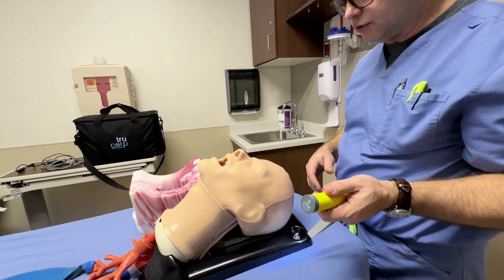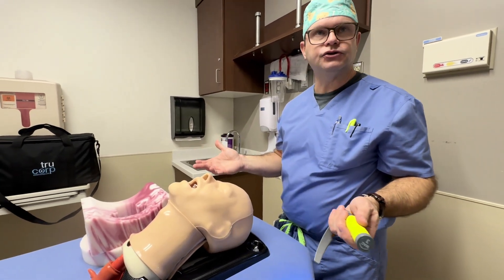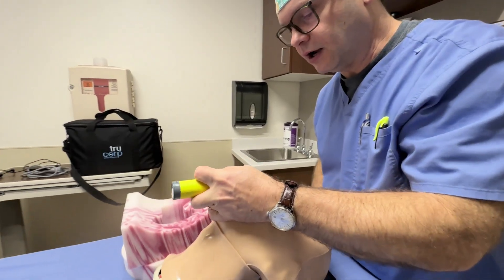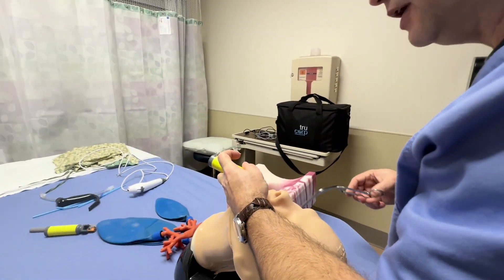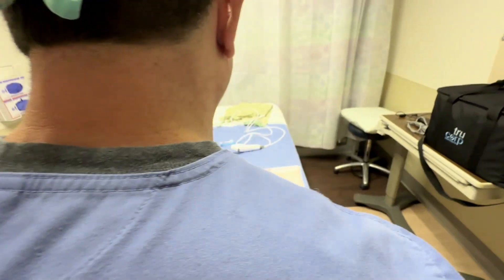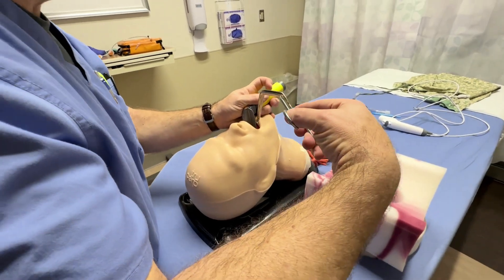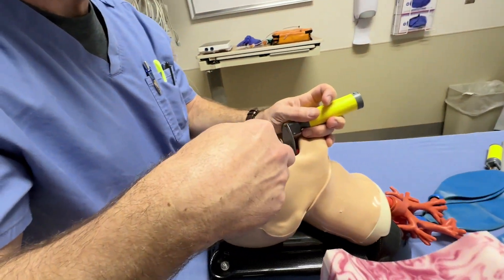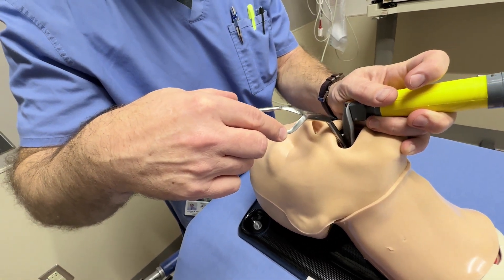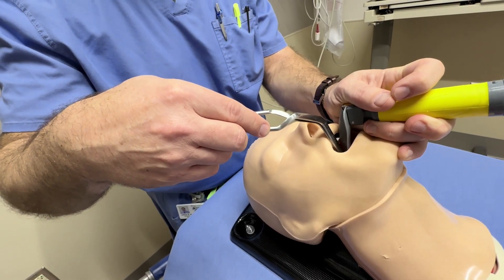A couple of ways that we use McGill's in the anesthesia world: one is obviously for foreign body extraction. We would first perform a direct laryngoscopy, identify the target foreign body that we're after. The nice thing about the McGill forceps is because of the way they're designed, the operator's hand is out of the way. We can see the device easily being inserted into the oropharynx here.